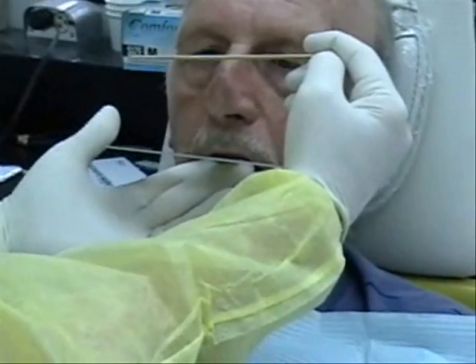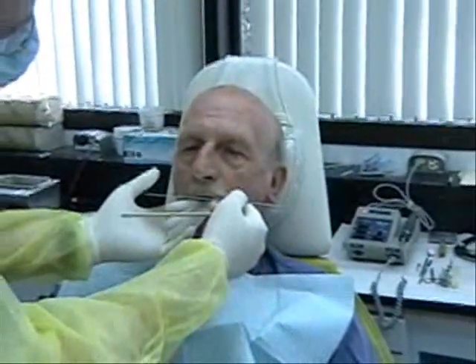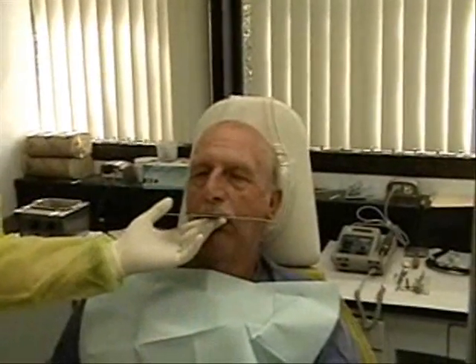Interpupillary? Yeah, I think to the horizon it looks great. I kind of go by the horizon thing — that's parallel to the floor. The thing is, if you point out that one pupil could be higher than the other, go by the horizon, because that gives you the more reliable reference.